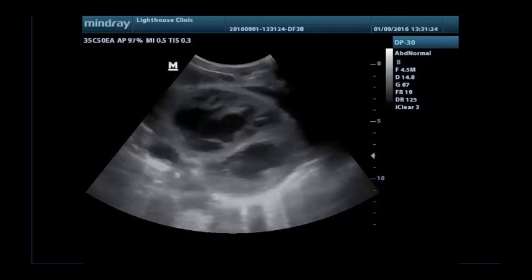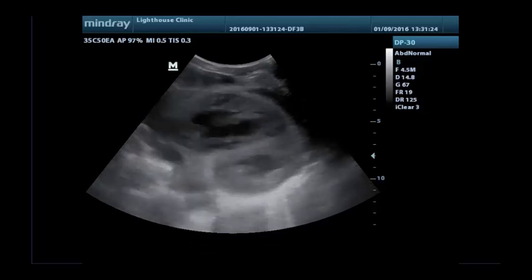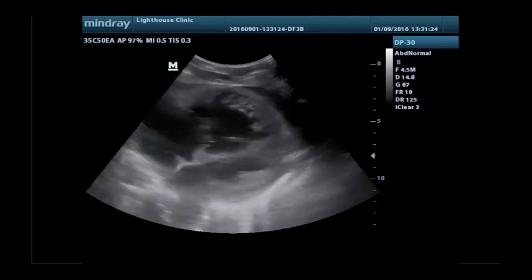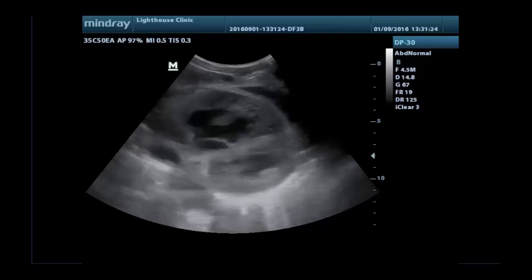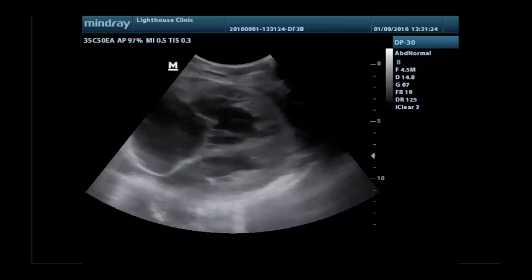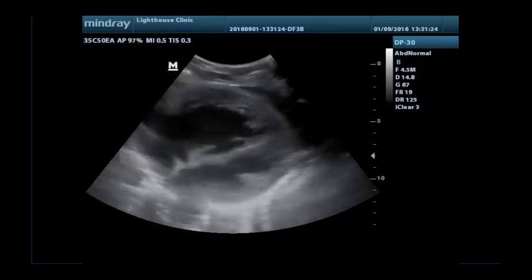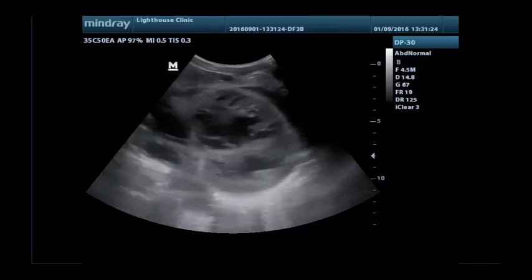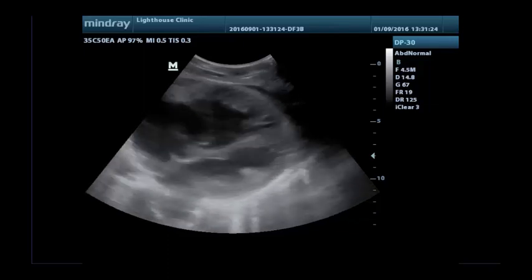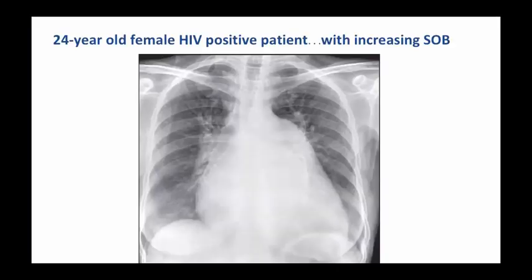It's not as compact as the left ventricle wall, but you can see these trabecular muscles more prominent than you usually see them. So this muscular hypertrophy, of course, needs time to develop. That is a sign that it is a longer standing process, because the heart had time to adapt to the higher workload.